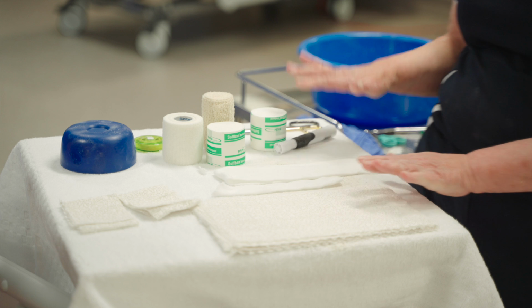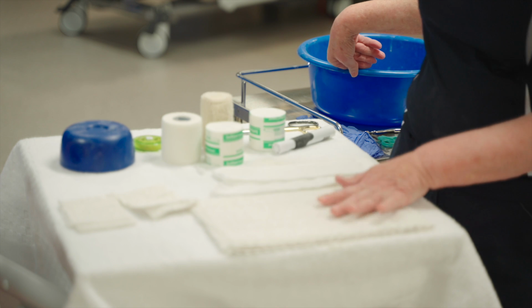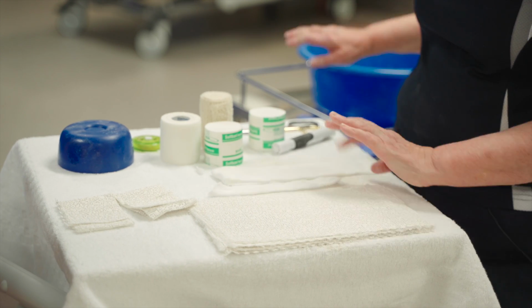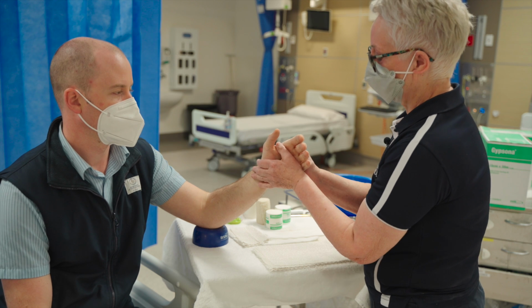So once you've got everything ready, including your water, and the water should be at room temperature. The reason we do the water at room temperature is when it mixes with the gypsona, it has an exothermic reaction and it creates heat. So we'll pop our patient's elbow onto the padding here and then we'll take a look at the patient.